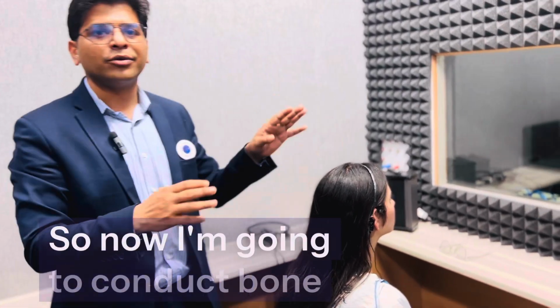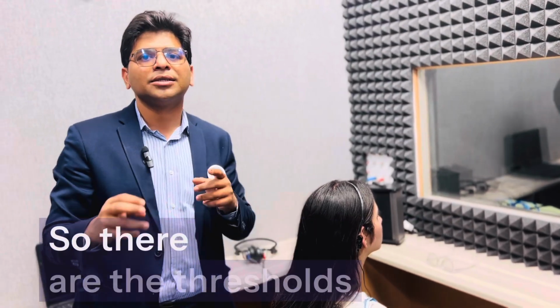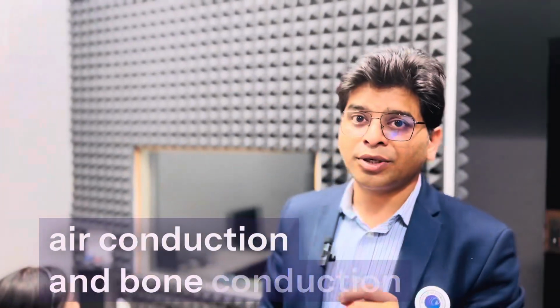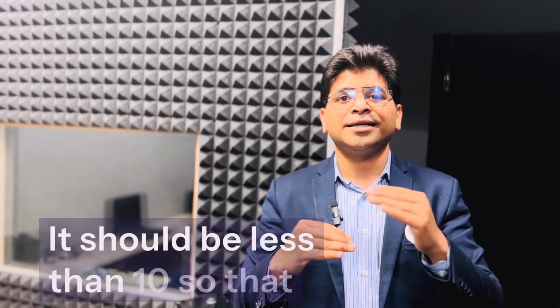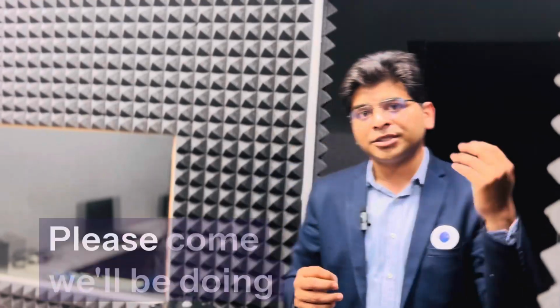So now I'm going to conduct bone conduction audiometry without doing masking. So there are the threshold or the findings we get in air conduction and bone conduction. And as an audiologist, we must be knowing there is a term called air bone gap. It should be less than 10 so that we can understand there is no obstruction at the level of outer or middle ear. Please come, we'll be doing it.